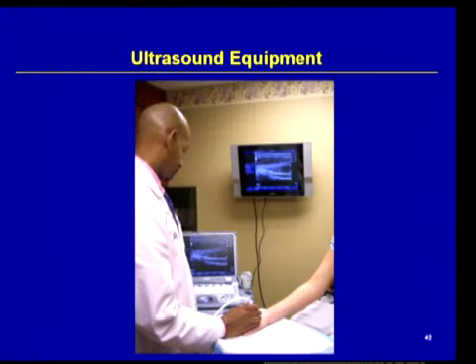This is an example of what I've done in my clinical practice. Here you see in the background the Logiq E machine over a patient, and then we've also added to the ultrasound room a flat screen monitor. Particularly, it comes in handy when doing needle guidance for intervention, for example, of the sacroiliac joints or for the facet joints of the spine.